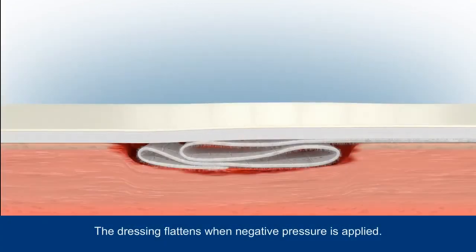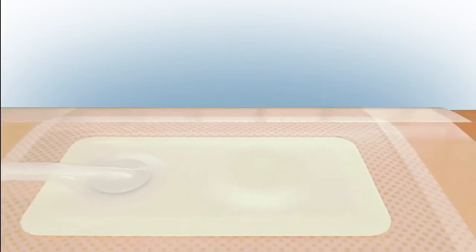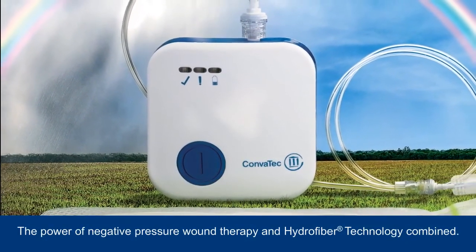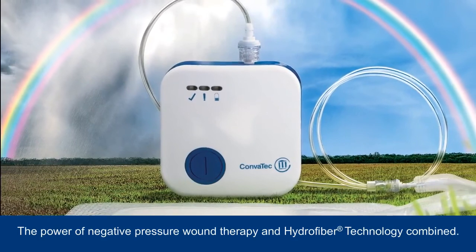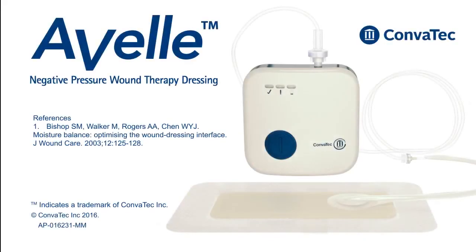The green tick indicator will then begin to flash as therapy is successfully restarted. When negative pressure is applied, air is sucked out of the dressing causing it to flatten. The innovative system brings together the power of negative pressure wound therapy and Hydrofiber technology, which is designed to help create a moist wound environment for healing.